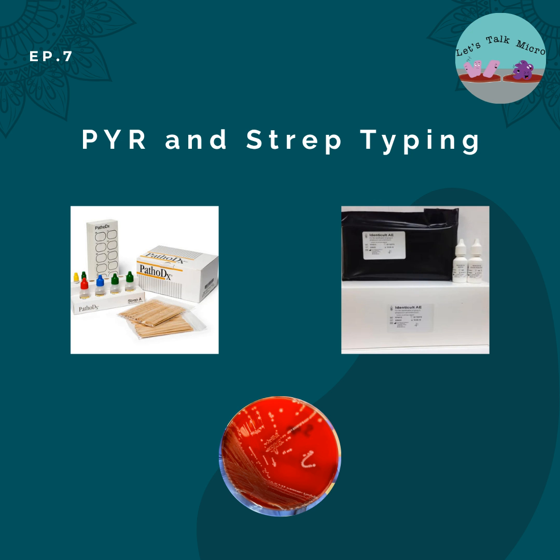But make sure that you read the package insert. As with any test, make sure that you read the package insert because it says that you can have some false positive reactions, like Staph saprophyticus. So if you get a positive reaction, make sure you correlate that with the morphology, meaning that for you to call it Staph aureus, you need to have beta hemolysis. If it's weak to none, because you can have weakly hemolytic Staph aureus, then go ahead and perform an ID by another method, like Vitek, MALDI-TOF, etc. Do not call it Staph aureus.